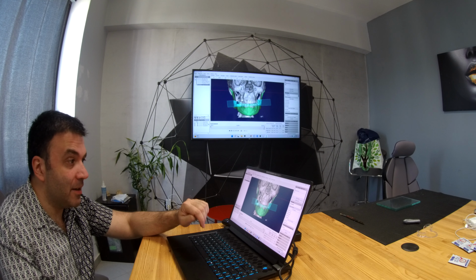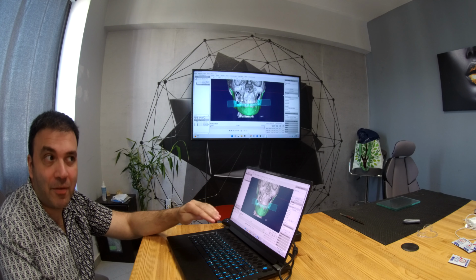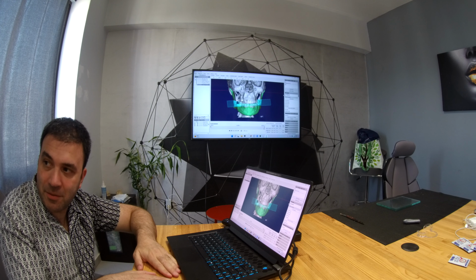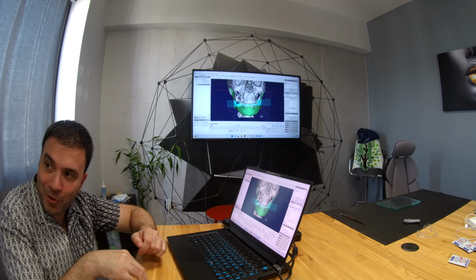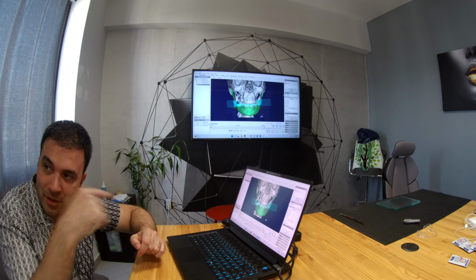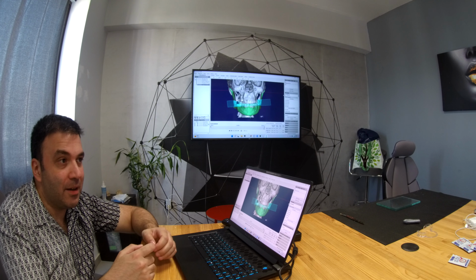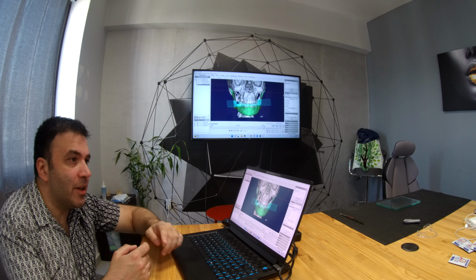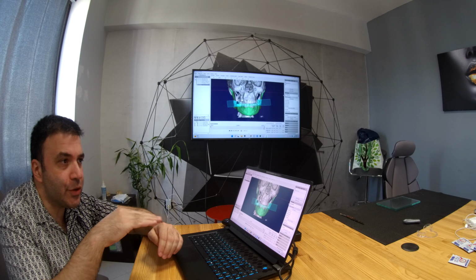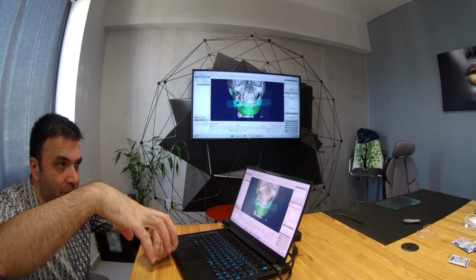Okay. But anatomically speaking, the fork is very easy to place in the model, and I remember that there was contact between the anterior teeth and the fork, and I used it as a reference when I was doing it without the bite fork. You didn't use it here? Because the quality of the scan was bad. I was using just the fork, and I was manually placing the model of the upper jaw.